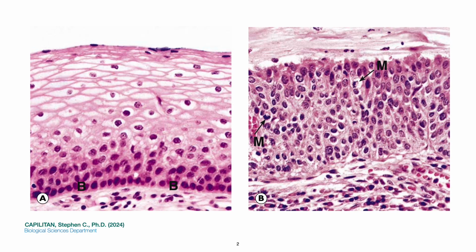Dysplasia is a morphological feature which is characterized by increased cell proliferation with incomplete maturation of cells. It occurs most commonly at the uterine cervix and in the skin. In letter A, it illustrates a normal stratified squamous epithelium from the cervix. Cell proliferation is confined to the basal layer, where the cells are small, uniform, and darkly stained. As the cells mature towards the surface, their cytoplasm expands and becomes more eosinophilic. Near the surface, the cells become progressively flattened. The ratio of nucleus to cytoplasm diminishes as the cells pass from the basal to surface layers.